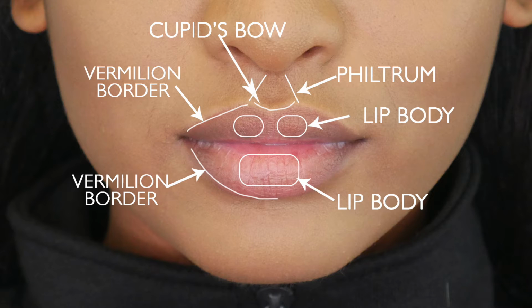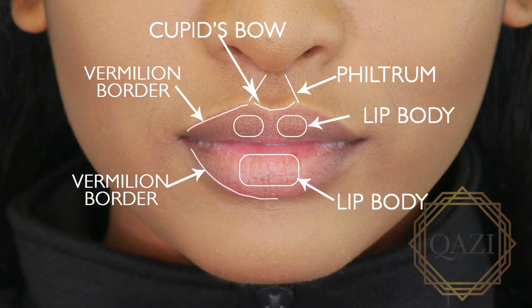So for today, I'm going to go over some of the techniques that I use to do lip injections. First, it's always really important to take a look at each patient's individual anatomy. What I like to do is always see how proportional the lips are at baseline. I then take a look and see where the patient's cupid bow is, as well as the body of the lip. I then also take a look and see what my plan will be for the vermilion border.